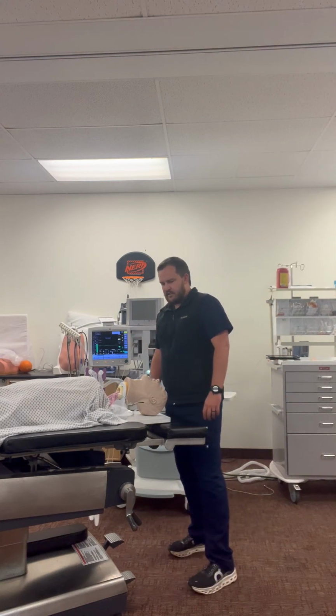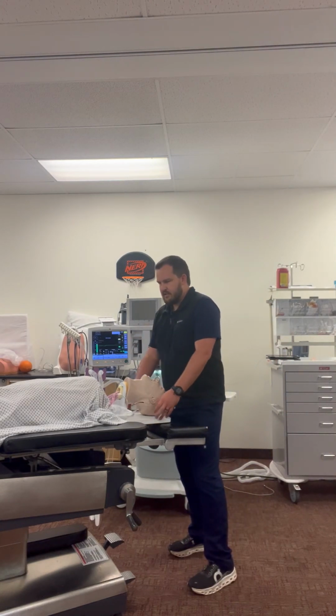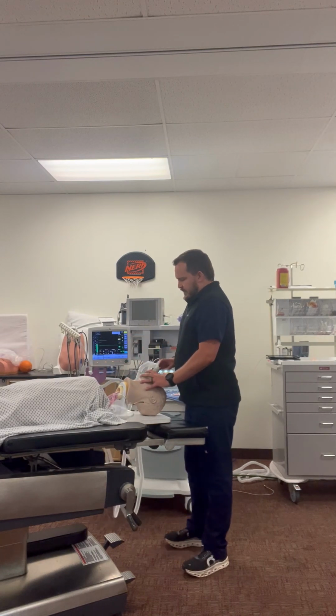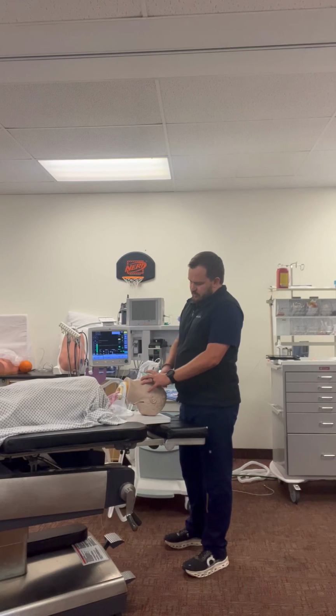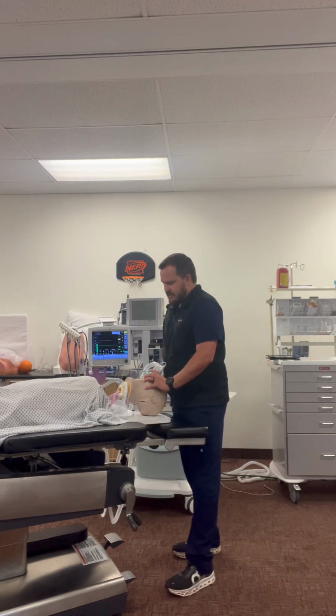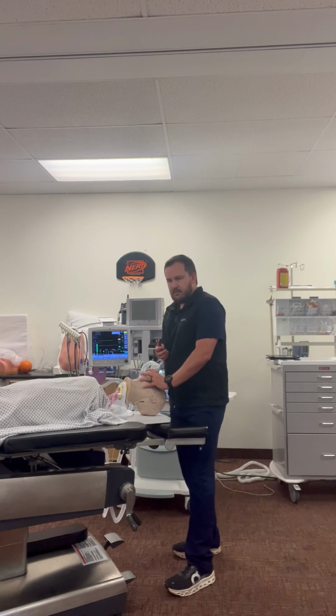My ventilator is set to the appropriate settings for this patient. I have him in here. I'm gonna now place the mask over and make sure it fits good. It should go over the bridge of his nose, over his cheeks, and on his chin. I'm gonna use the CE method, which will be good also to open up the airway because I can perform a jaw thrust, but I still have my OPAs if I need them.